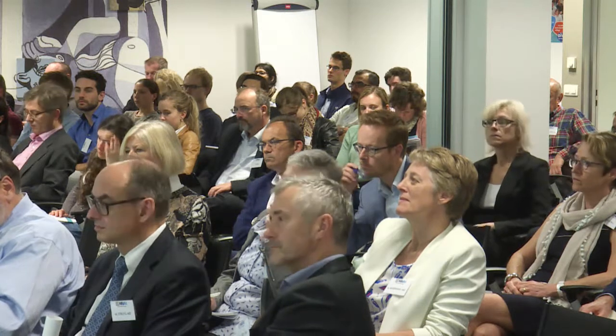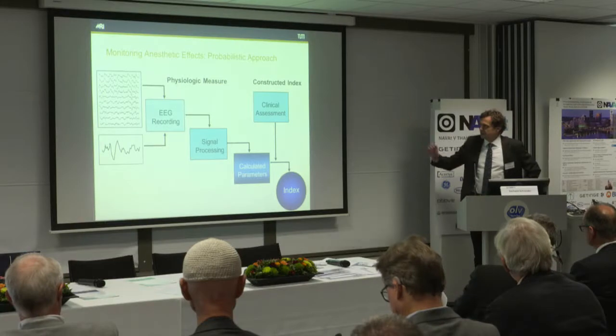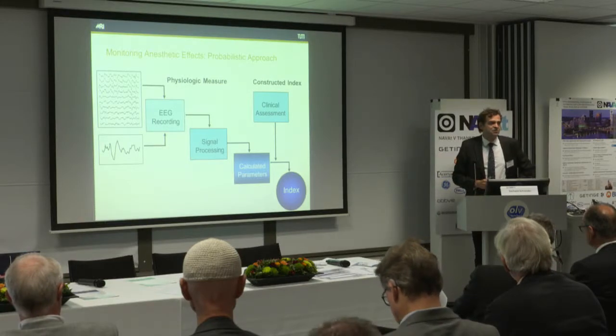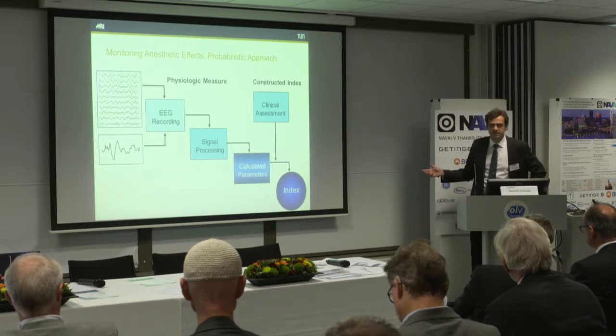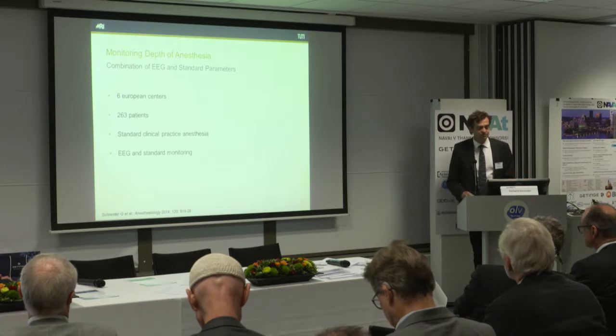The indices that we use at the moment go one step further. They integrate clinical assessment that has been performed during the design studies, and by different statistical methods, this information based on clinical assessment is combined to calculated parameters to produce an index which reflects the hypnotic level of anesthesia. So it's not really a physiologic measure.